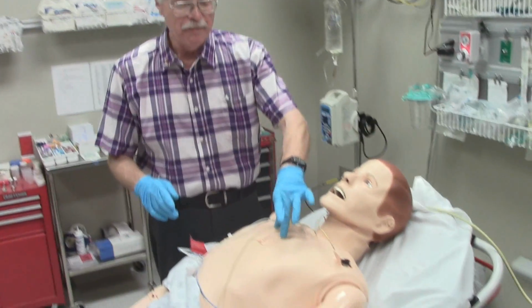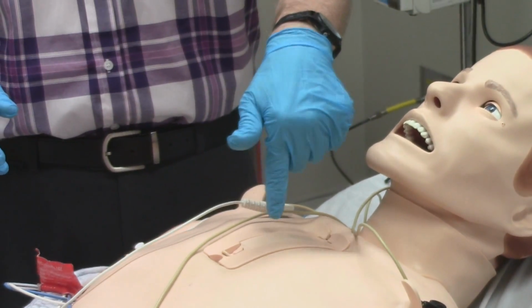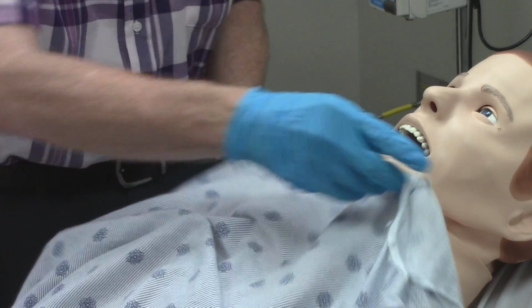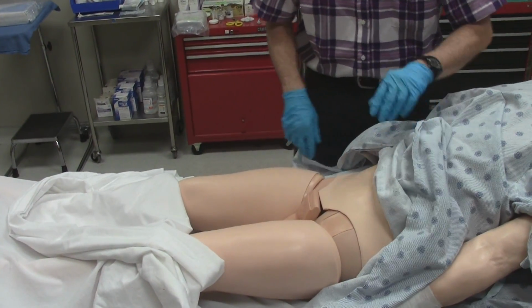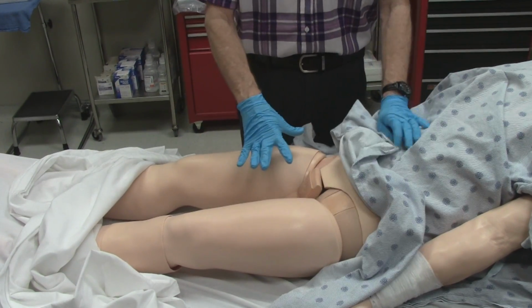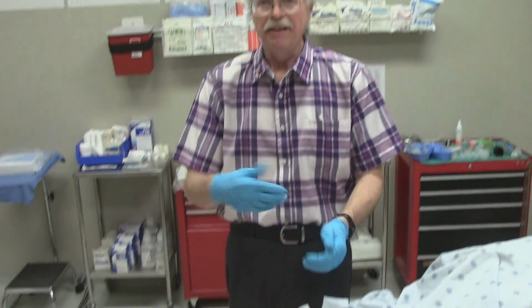The site here in the middle of his chest is for placement of a sternal intraosseous line. That probably will not be used that frequently. If we move downward toward the patient's legs, you'll notice that he does have genitalia. There are inserts that can be placed in the mannequin to make them either male or female. These inserts can be changed out.